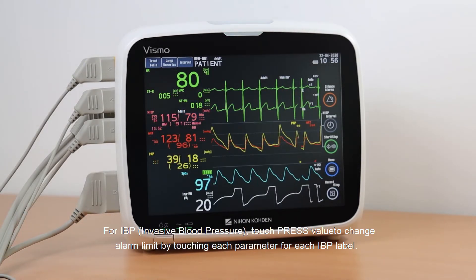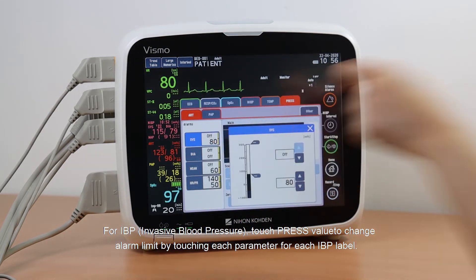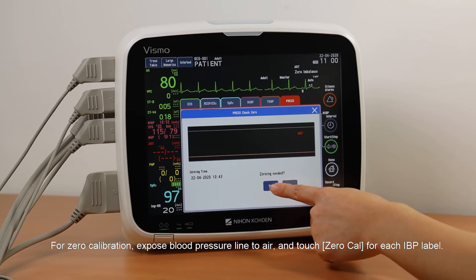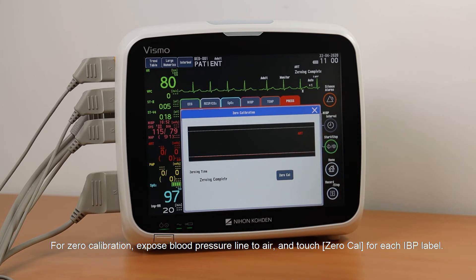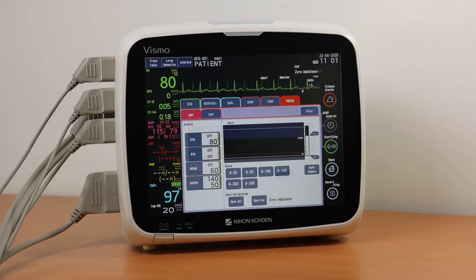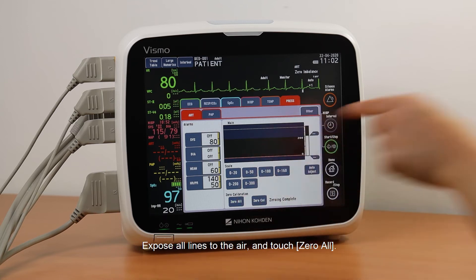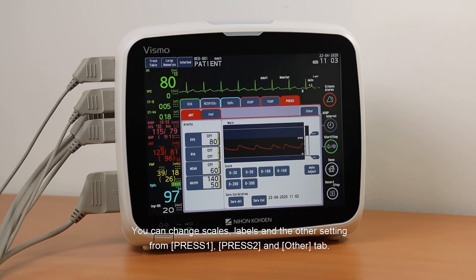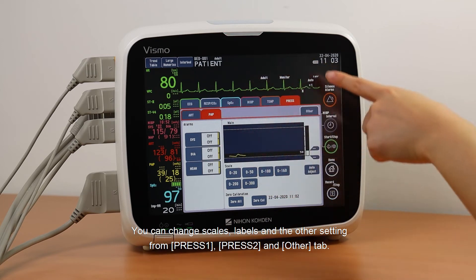For IBP (Invasive Blood Pressure), touch Press to change alarm limits by touching each parameter for each IBP label. For zero calibration, expose the blood pressure line to the air and touch Zero Cal for each IBP label. You can also perform zero calibration for all lines at the same time — expose all lines to the air and touch Zero All. You can change scales, labels, and other settings from Press 1, Press 2, and the Other tab.